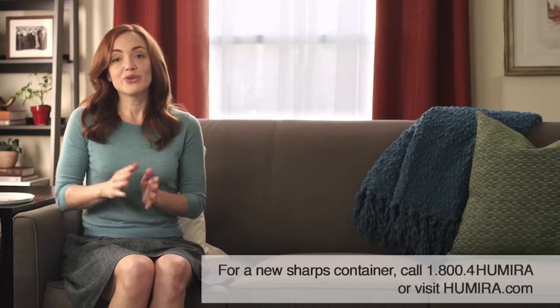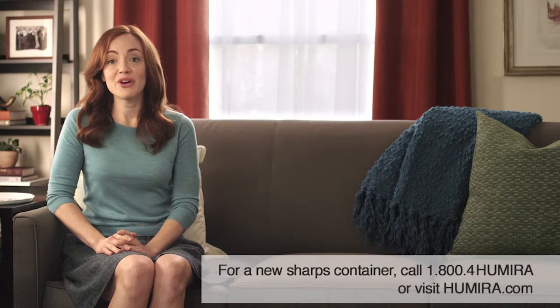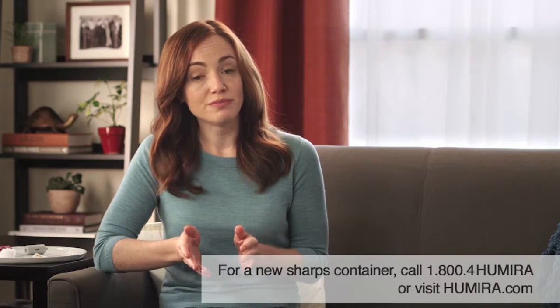Use the FDA-cleared sharps container, not your household trash, for your used pen. And of course, it's important to keep the container out of the reach of children. You can request a new sharps disposal container at no additional cost from the Humira Sharps Disposal Service. When the container is about 2/3 full, request a new container. Remember, do not throw away the pen in your household trash and do not recycle your used sharps container. If you don't use the Humira Disposal Service, follow your community guidelines.